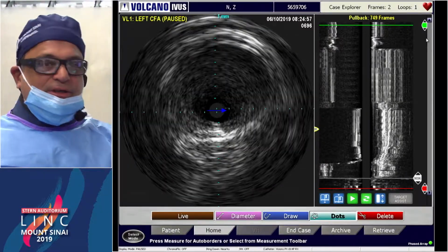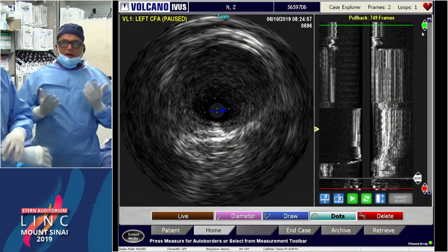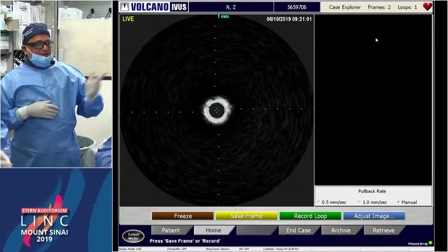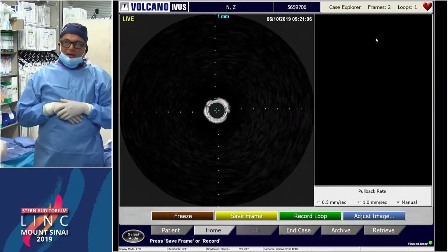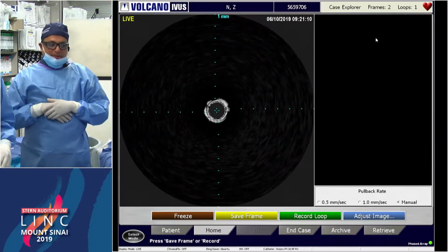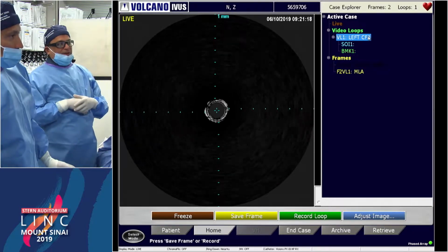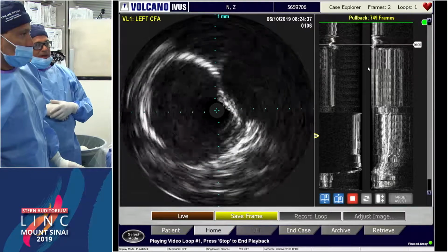So at this stage, we decided to use a filter, and I guess this is kind of the question. In our feeling, calcified lesions, we published our series of 560 patients in JACC Interventions regarding the use of filter in atherectomy, and this is the kind of lesion we feel embolizes, at least in our hands. So we found that putting a filter here would be good. We decided to use an Abbott EmboShield. Show the EmboShield, please. We decided to use an Abbott EmboShield at the level of the profunda, and that's kind of the reason why I wanted to ask what you guys would have done.